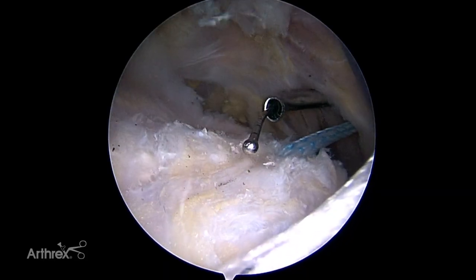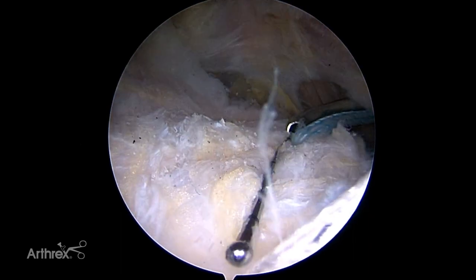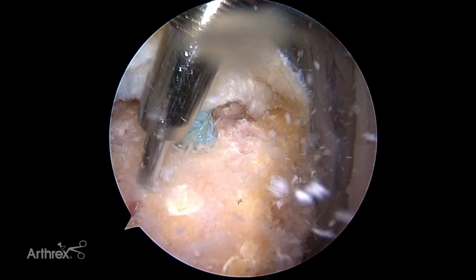A measuring device is now used to determine the exact distance between the two sets of sutures that have been passed through the edge of the rotator cuff. A power pick is used to create vascular channels to enhance blood flow for healing.